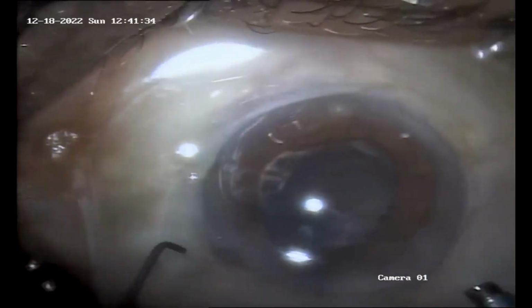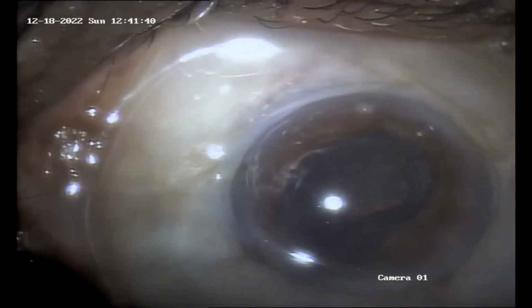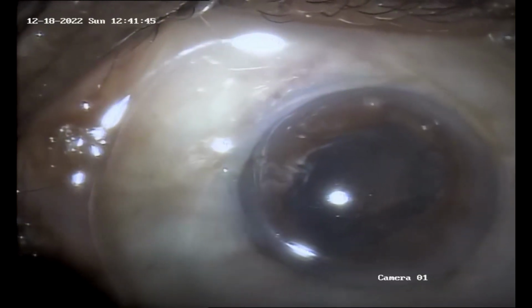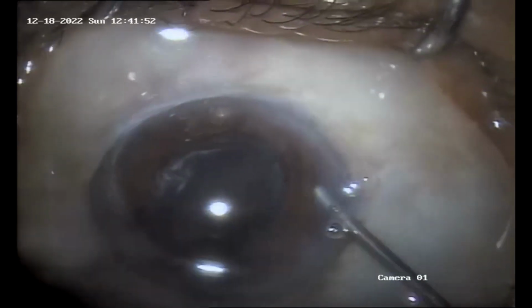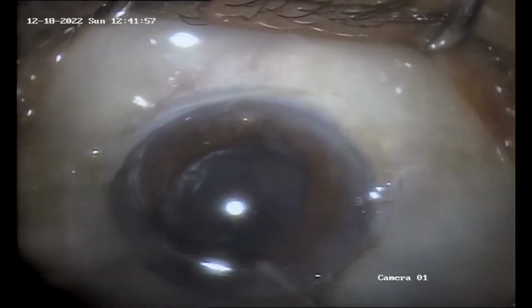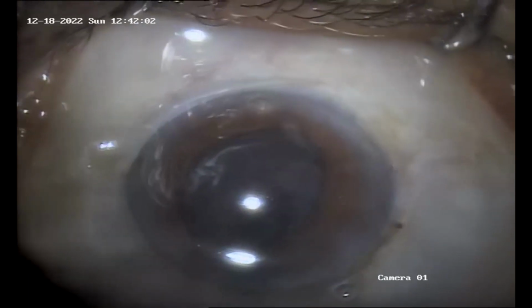The equatorial approach is the best possible solution in the cases when a bowl nucleus is formed or when the nucleus is quite adherent and not leaving the bag.